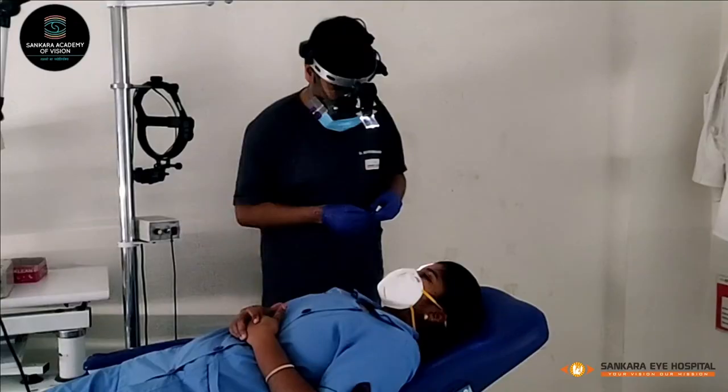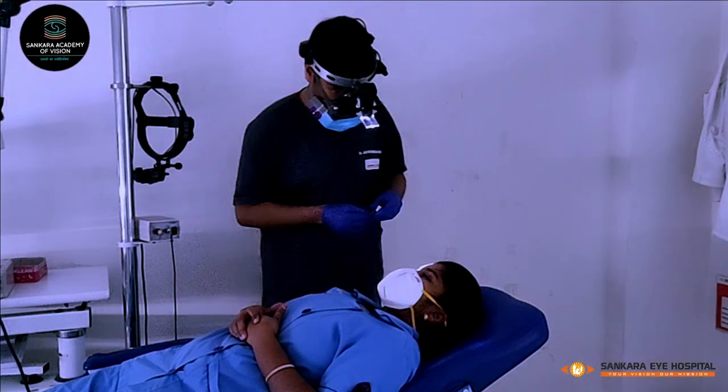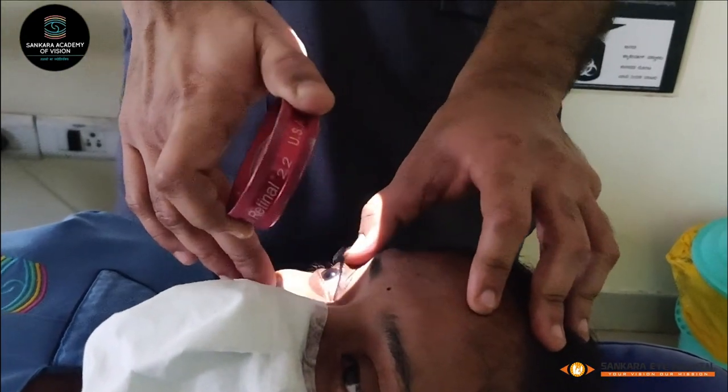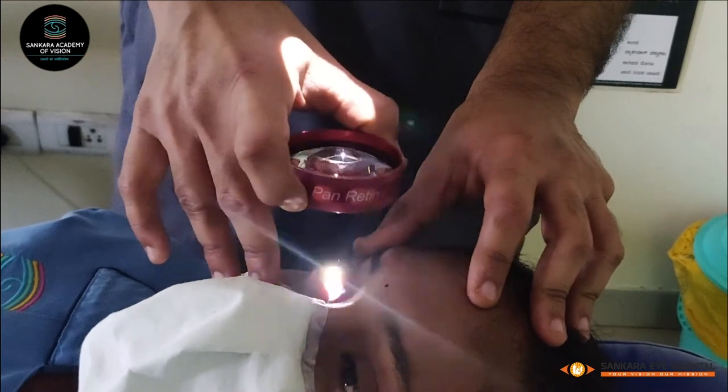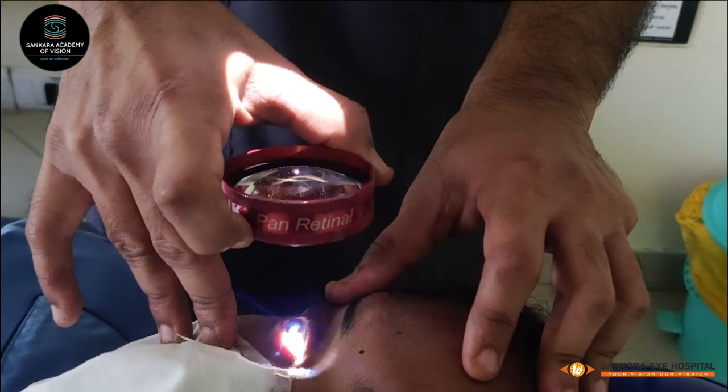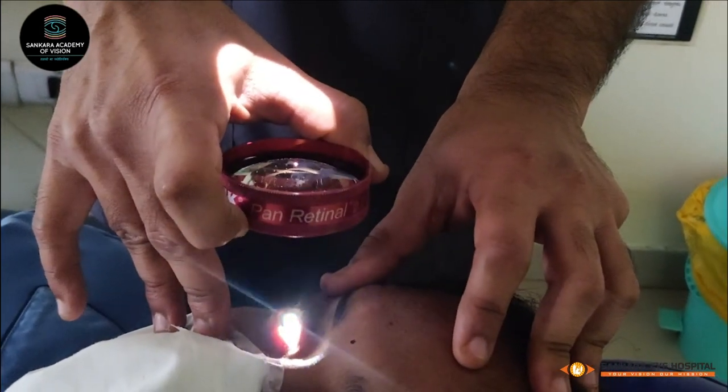The patient should lay flat in a reclining chair with slight extension of the head, with room for you to move freely around the head. Room lights should be dimmed for better visualization. The condensing lens is grasped between the bulb of the thumb and tip of the flexed index finger. The middle finger holds one lid and also acts as a pivot for movement of the lens. The thumb of the other hand can be used to hold another lid.